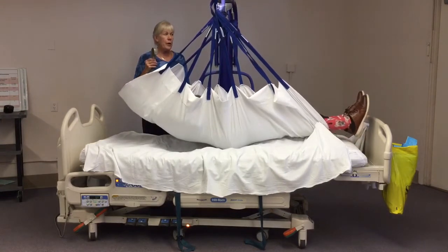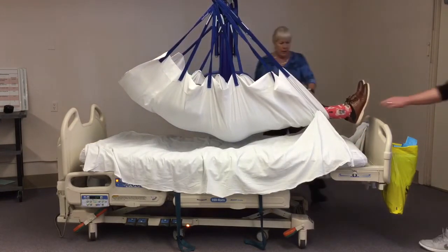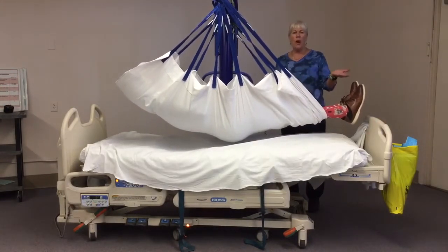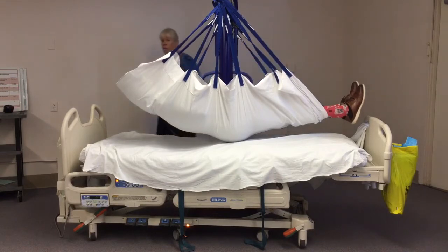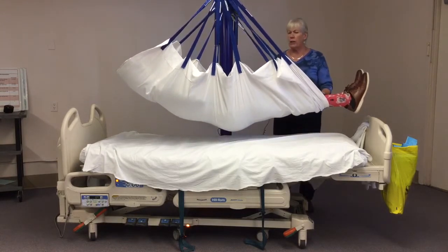The reason for the gray and the blue is because what we really want our patient to be in is in this hammock position. We don't want their feet to be above their head, and we don't want a lot of arching in the lumbar spine. So check with your patients and make sure that they feel comfortable. You may have to adjust the loop sling, the loops and their colors based on the length that you need, okay? So what we see here is that now we have our patient up off the bed.